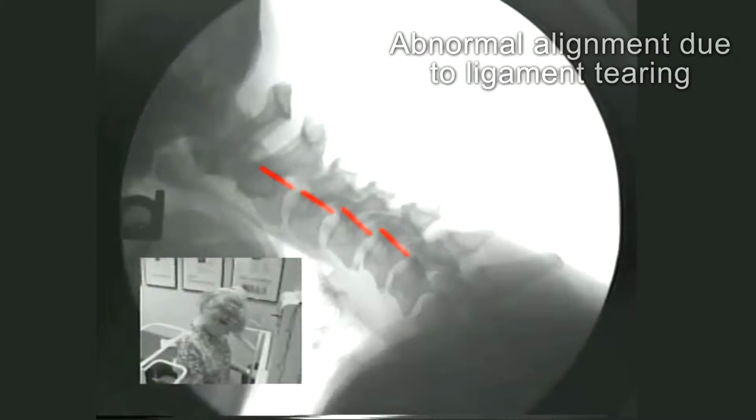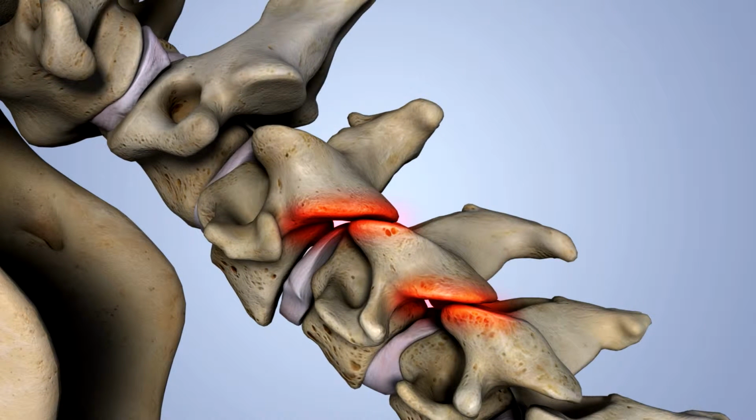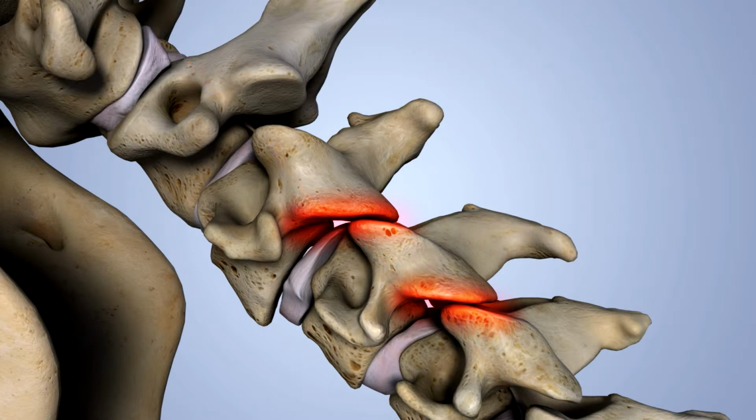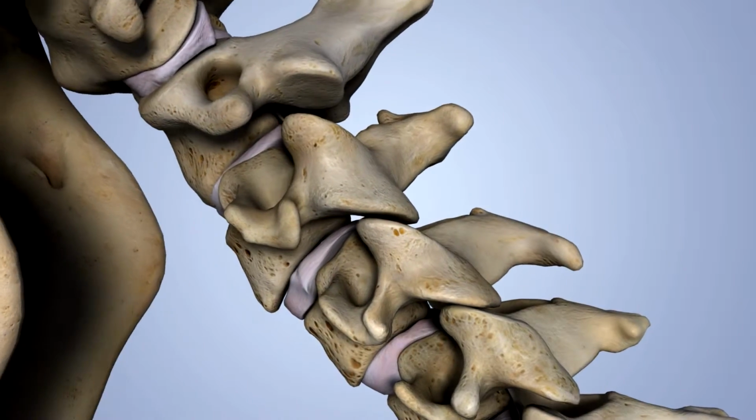So now when this person bends forward, here's an x-ray, this is the actual motion x-ray. If we draw a line in the back of this one and the back of this vertebra, they don't line up anymore, they don't connect. And that means that that ligament right there that should hold it has been torn. Can't see the ligament, but you can see the result of it being torn. The vertebra has slipped forward, bone is hitting bone, and then the nerve that comes out from here ends up getting pinched and irritated because of that excessive movement. It shouldn't move, it should have stayed lined up, but with the ligament torn, it allows that vertebra to move forward.